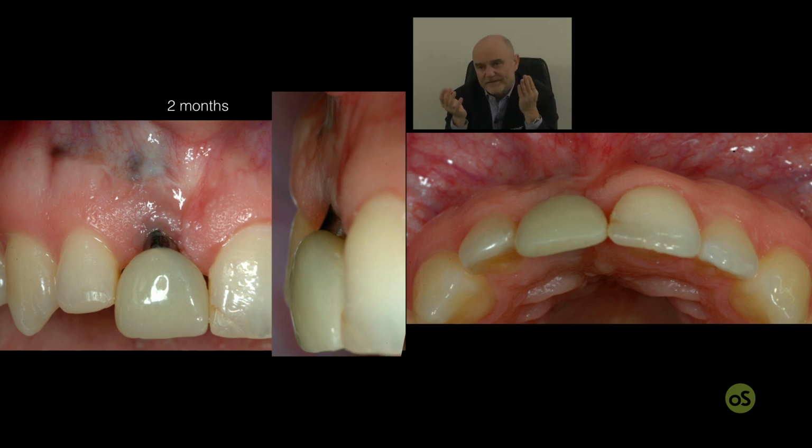At a certain point, you cannot expect any more improvement, because the more coronal you go, the more the abutment becomes buccally displaced due to the bad implant positioning, so the soft tissue cannot grow above something that is exactly in the opposite direction with respect to the ideal direction for creeping.